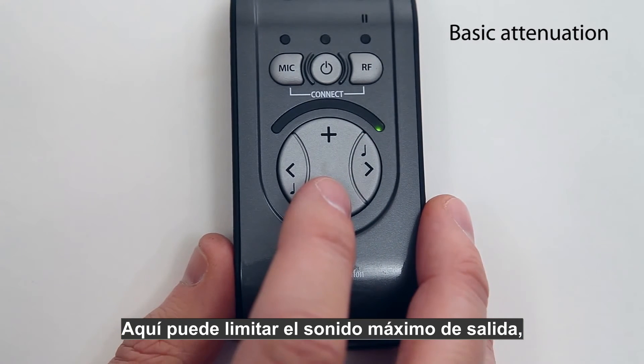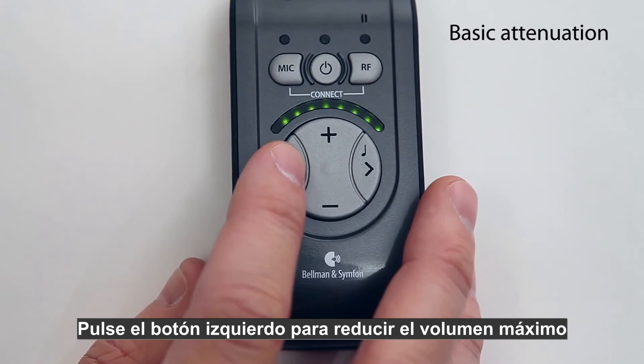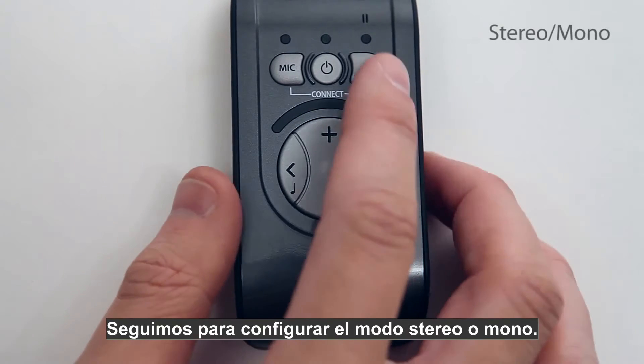Stepping forward brings you to the basic attenuation setting, where you can limit the maximum sound output — for example, if you want to limit the volume for a child. Press the left tone button to reduce the maximum volume and the right button to increase it. Stepping forward again takes you to the stereo or mono setting for line in.